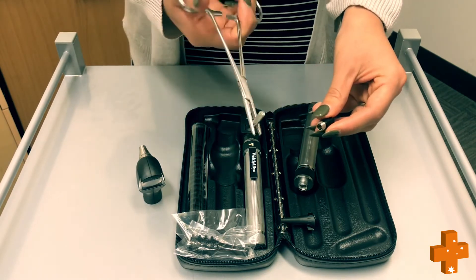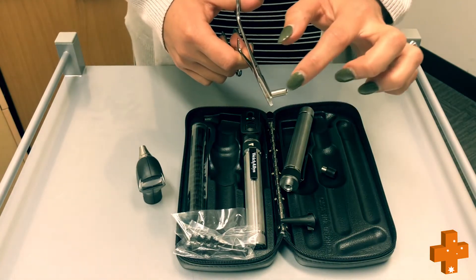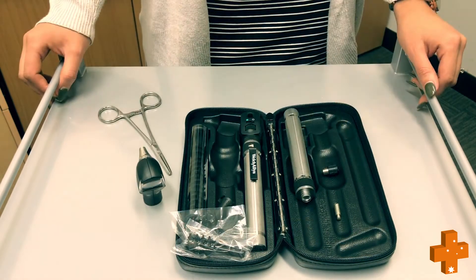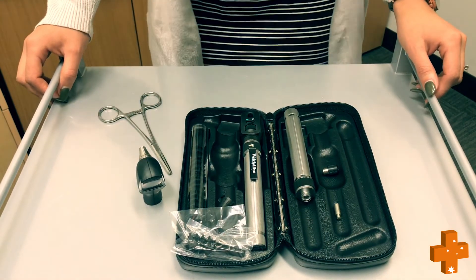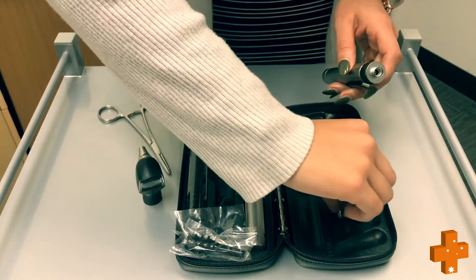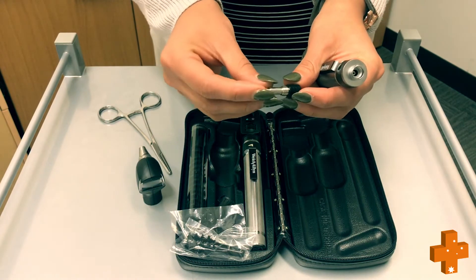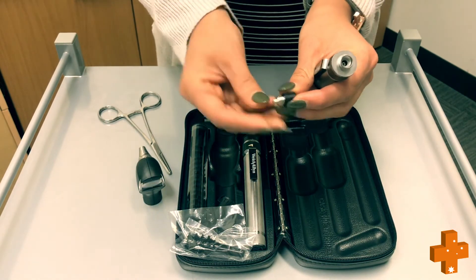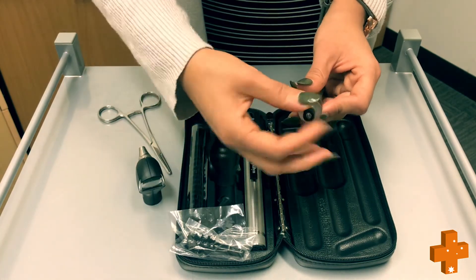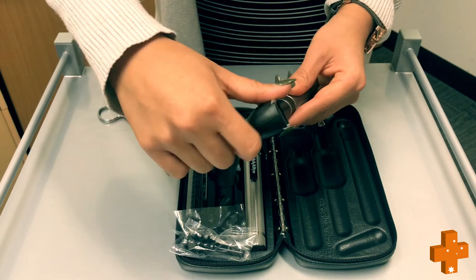Be careful not to touch the glass of the globe. The serial number will be located on the side of the globe. Now that you've obtained your serial number and have ordered your new globe, you can then insert your new globe. Ensure not to touch the glass. Screw the globe in and replace the head.